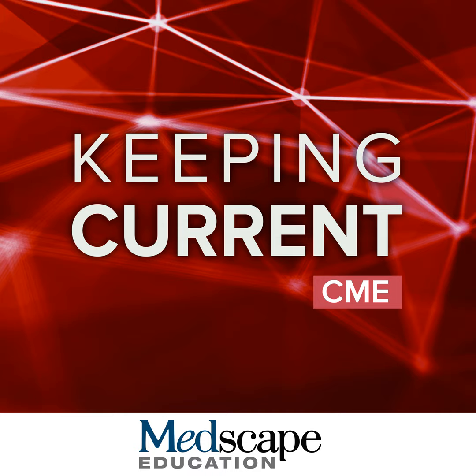We look at special populations of patients. If patients have renal failure, of course, that's going to influence our decision to give contrast or not. We'll try to avoid it even more. And also, if we know that a patient is going to have repeated scans, we're also going to be a lot more conservative in terms of administering contrast. And then again, at the end of the day, we try to take into account all of these factors. We look at each patient individually, at the clinical question that is asked, and we make individual decisions for each patient.